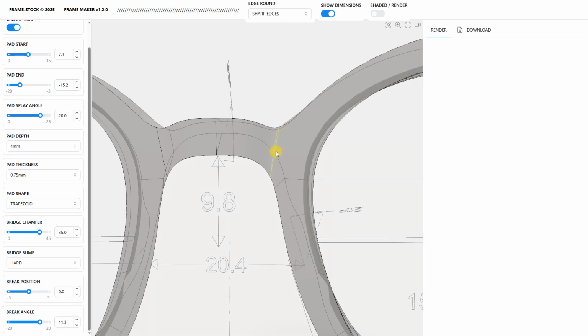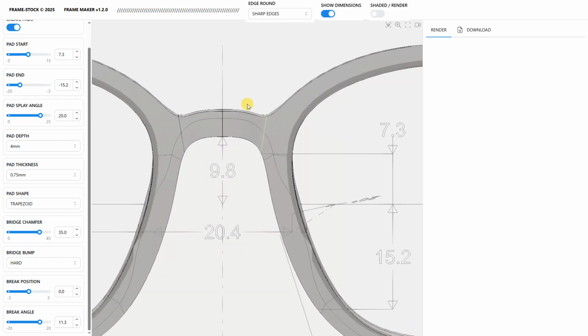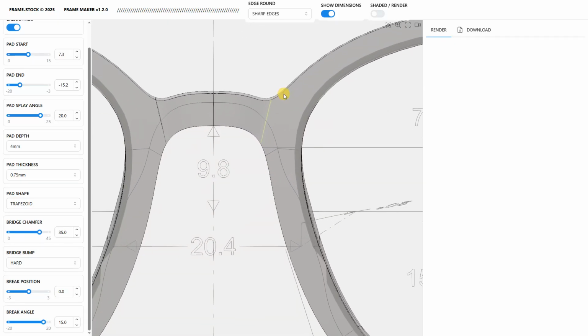So this green line, if we look at it from the front, sorry, that green section, was tilted to the left. I needed to tilt to the right, and I can tilt it even more. Let's say the maximum is 20. I'm going to give it 15, like so, because I want to accompany this shape a bit more, and I can move it left or right a bit more.